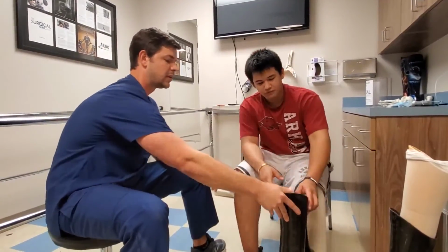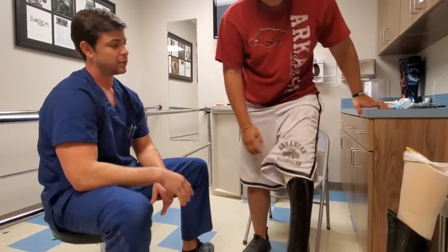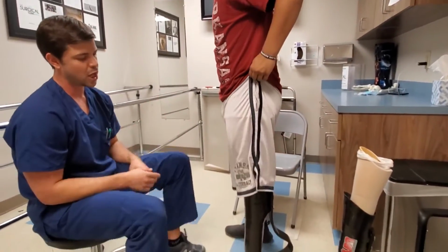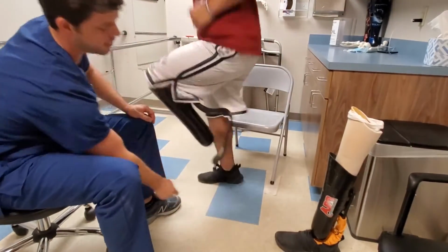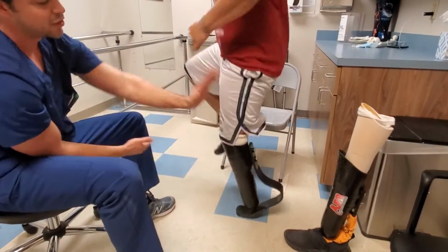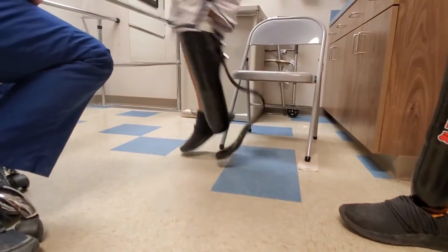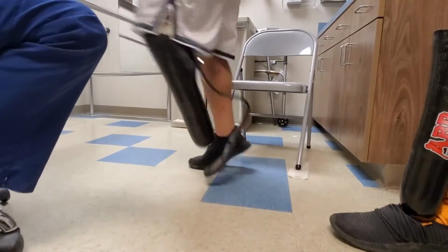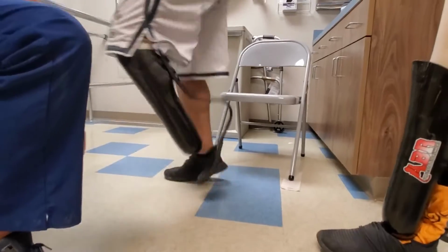So this is his running blade. He's going to slide that on. And then just face me if you don't mind, Fabi. Some things we look for is when he's kind of jogging in place, just kind of do some high knees for me there, Fabi. We're always looking to see where he's striking on that blade. And so the further back you're on the blade, the more hyperextension you're going to get. The further you're on the toe, the more flexion you're going to get. And so when we align these, we try to go about 1.5 inches back from the front of the blade. And this is kind of a good test to see how much compression you're getting from the blade and where he's striking on it.